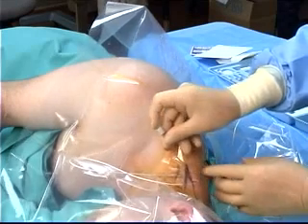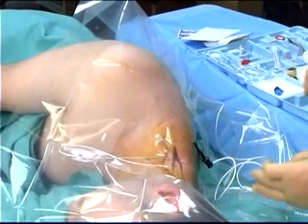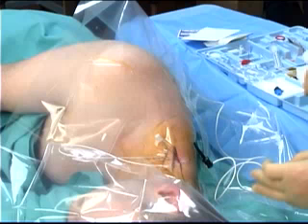The catheter will dislodge if it is not secured. The best method of securing the catheter is by subcutaneous tunneling. This is done by first placing the inner stylet of the needle subcutaneously from a point approximately 1 to 2 millimeters from the catheter exit site if a skin bridge is required to where the tunneling is anticipated.